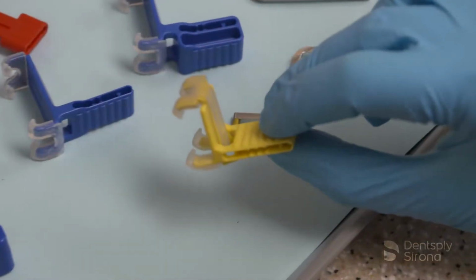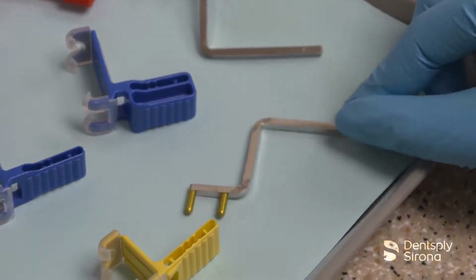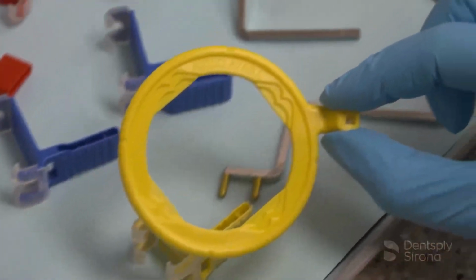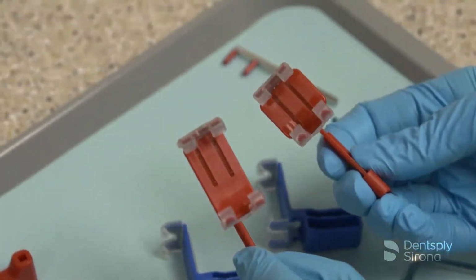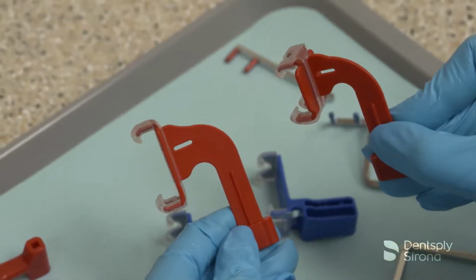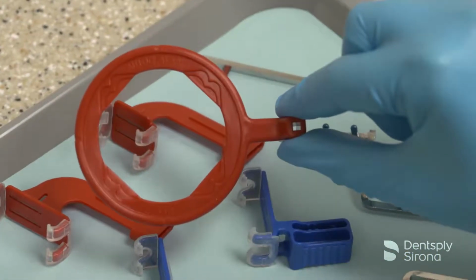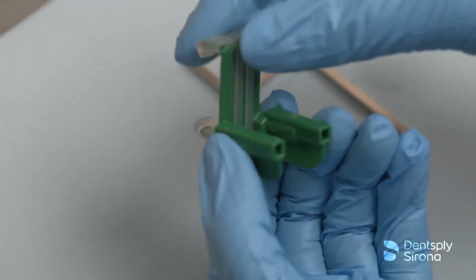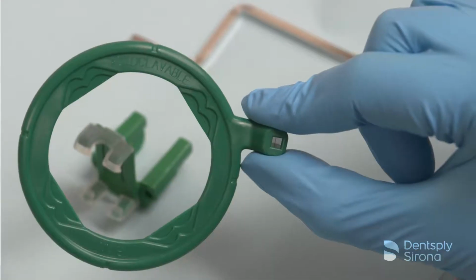The yellow bite block is for posterior periapical radiographs and corresponds with the metal arm with the yellow pegs and the yellow ring. The red bite block is used for bite wing radiographs and is available in a horizontal or vertical orientation and corresponds with the metal arm and the red pegs and the red ring. There is also a green bite block for use in endodontic radiographs and has a metal arm and a green ring.